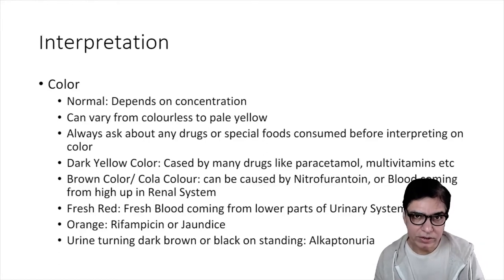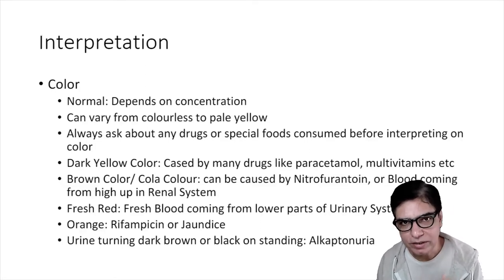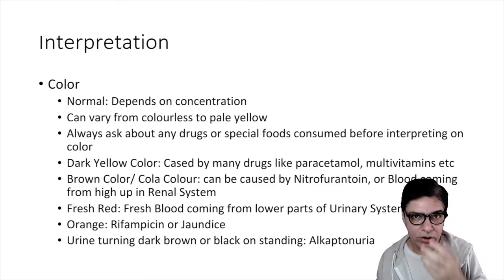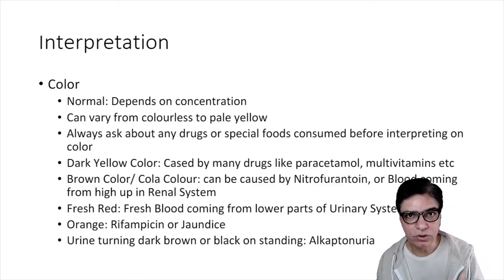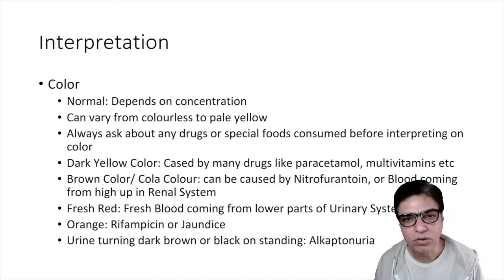But before that, it's very important that once you get a clean catch or a suprapubic aspirate, you have to look at the color. Now the color, you have to look with your eyes. Obviously the machine does not interpret the color, it's your eyes, and based on your knowledge you will interpret what that color means. So the normal color of the urine sample depends on concentration.